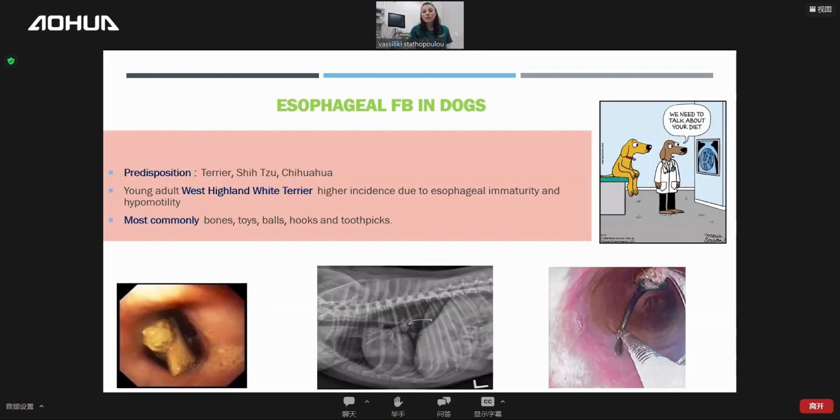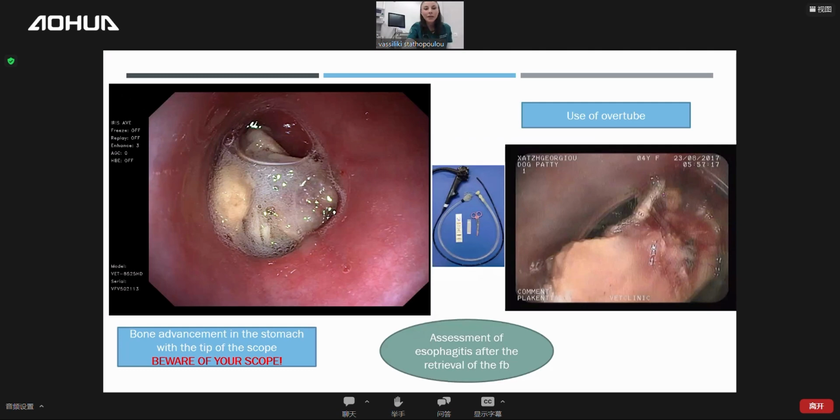In dogs, there is a predisposition in terrier breeds, of course. Most commonly bones, toys, hooks and toothpicks. The hooks are a bit difficult. I'm going to show you a lot of cases and a lot of tricks and tips on how to remove hooks in the webinar that will follow in the next months.